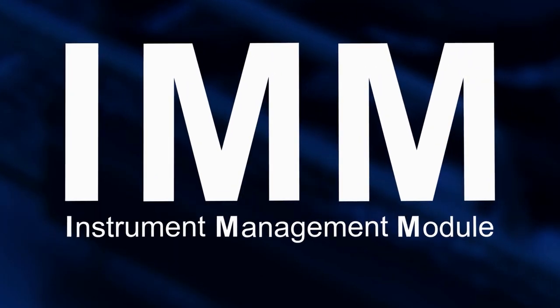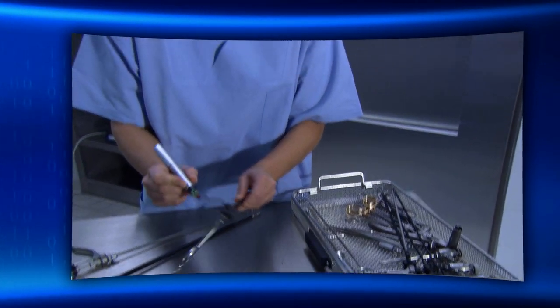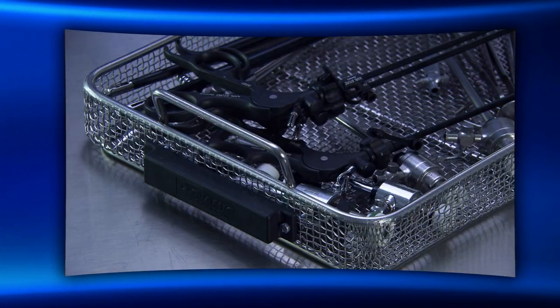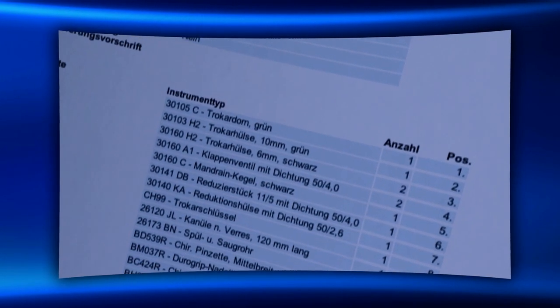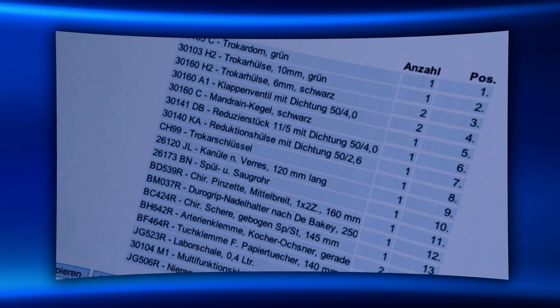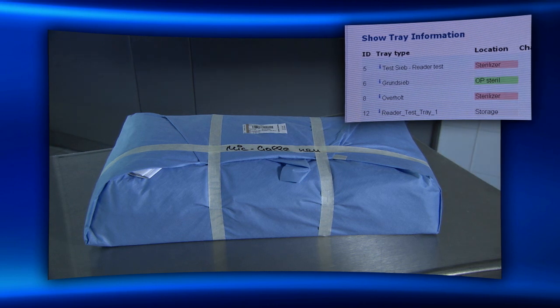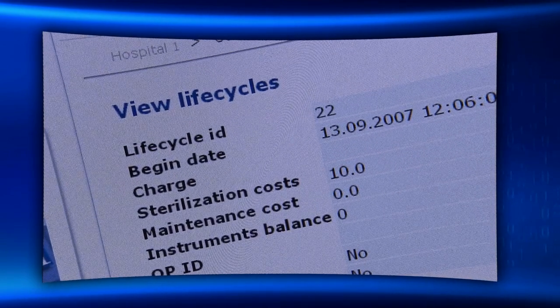Instrument Management Module. With the IMM and automatic tracing, complete life cycles of instruments, quantities in stock and storage are made transparent. Managing inventories such as delivery, usage and maintenance, allowing costs to be allocated specifically to individual cases.